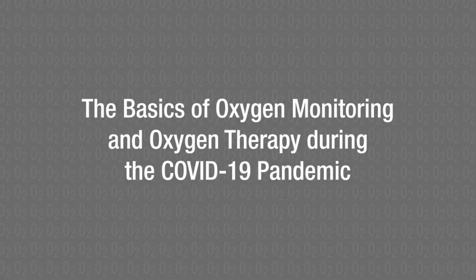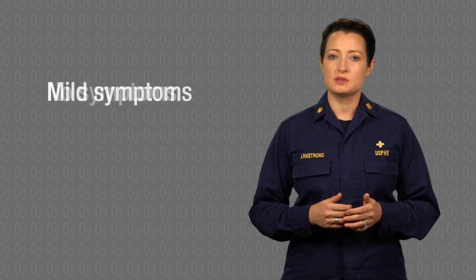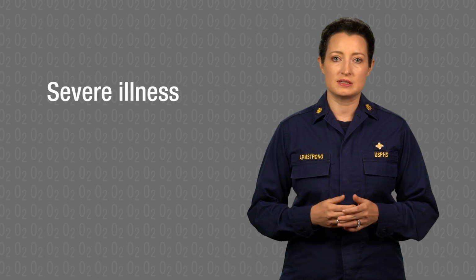The basics of oxygen monitoring and oxygen therapy during the COVID-19 pandemic. As a healthcare provider, you know that people with COVID-19 can have a wide range of symptoms, from no symptoms to mild symptoms to severe illness. Many people with COVID-19 have low oxygen levels, a life-threatening condition.